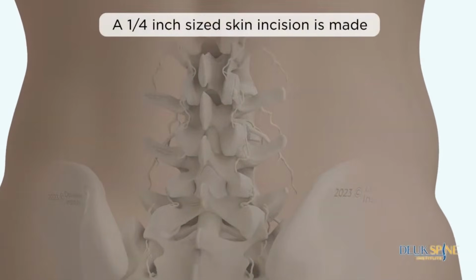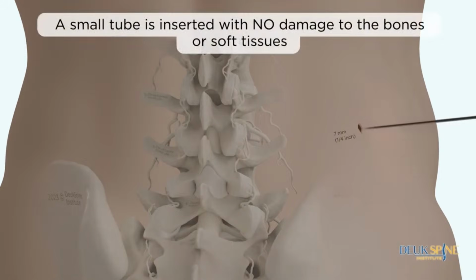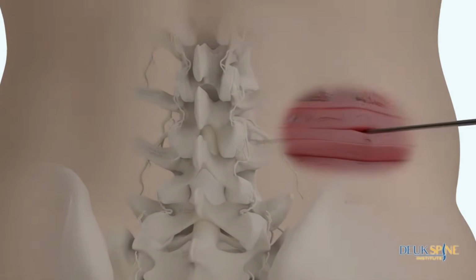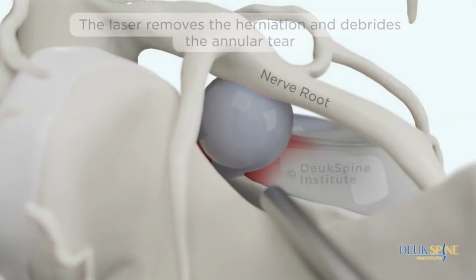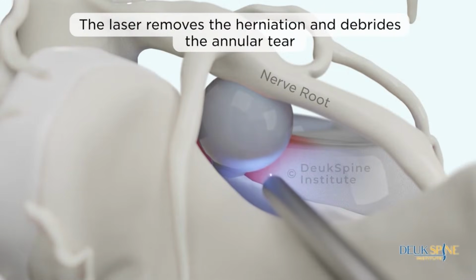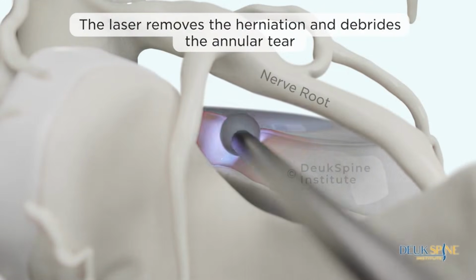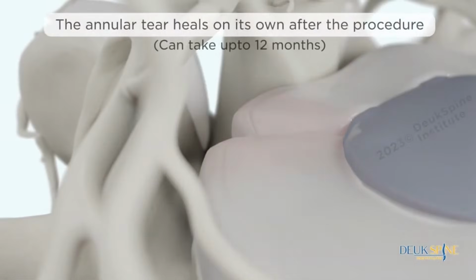A quarter-inch sized skin incision is made. A small tube is inserted with no damage to the bones or soft tissues. The laser removes the herniation and debrides the annular tear. The annular tear heals on its own after the procedure, which can take up to 12 months.